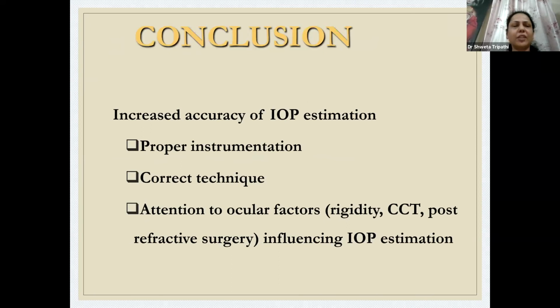Concluding, I would say that increased accuracy of IOP estimation can be achieved by proper instrumentation, correct technique, and attention to ocular factors like rigidity, CCT and all, influencing the IOP estimation.